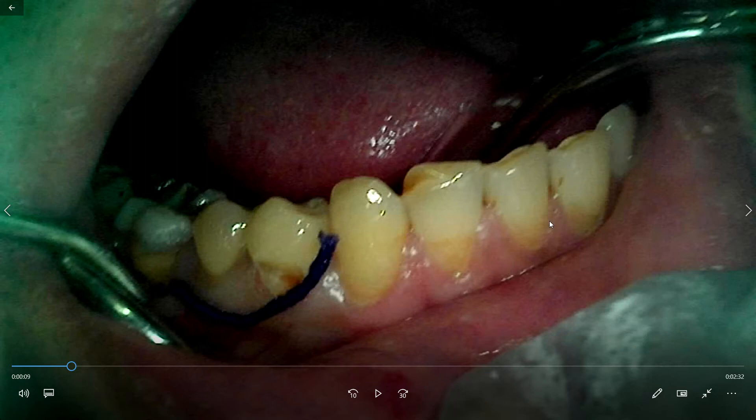In this video, we will learn how to place a gingival retraction cord. Gingival retraction cord is usually used for retraction of the soft tissue surrounding the tooth structure, especially before taking the impression for indirect restorations like crowns or veneers, to expose the cervical margins — especially if these margins are subgingival — so we need to expose them to take the impression of these margins.